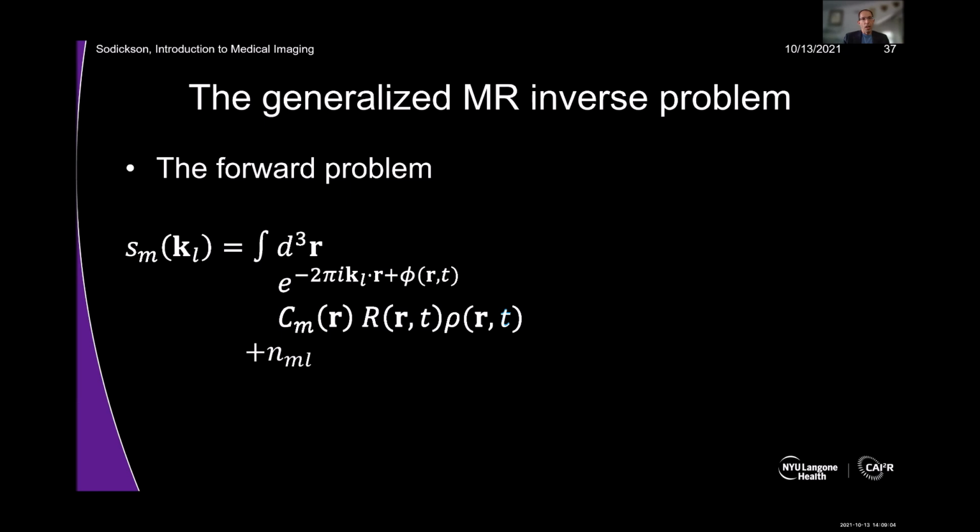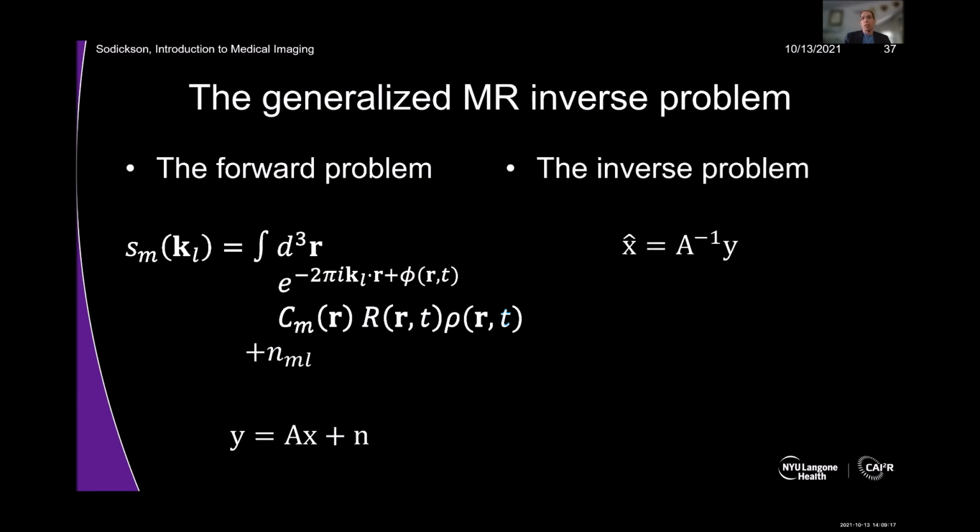So rather than trying to address this integral equation, we, again, as you heard from Urvashi, discretize it and frame it in this classic inverse problem format, y equals Ax plus n. So once again, we need to solve the inverse problem. How do we do it? Well, when we have non-Cartesian K-space trajectories, we shamelessly steal a technique from you guys in radio astronomy. We use regridding plus an inverse FFT. That's standard, and it was lifted explicitly from astronomy papers.